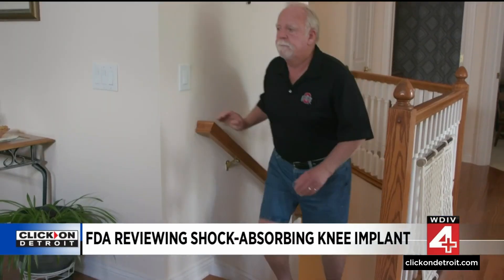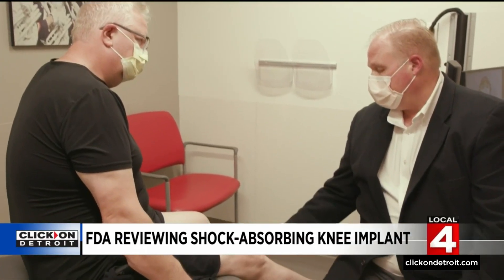Three years later, Chuck is still on the move, as are others who participated in the clinical trial. Over 90% of patients have gotten back to a lot of further activities that they hadn't been able to do for quite some time, and had significant improvement in pain and function.